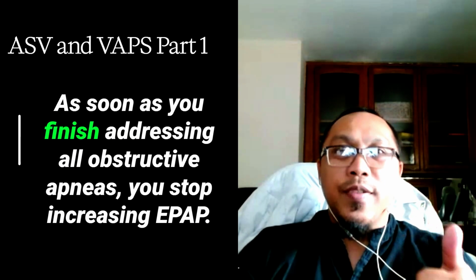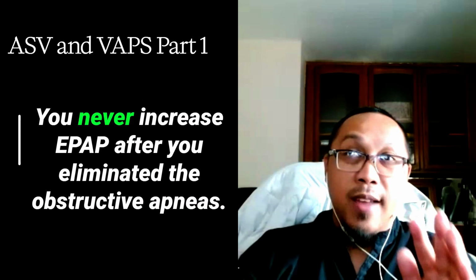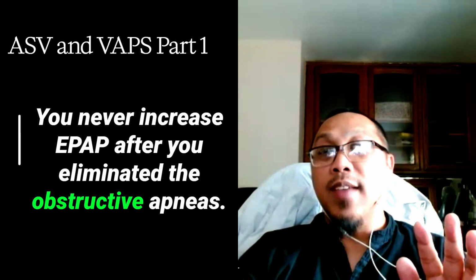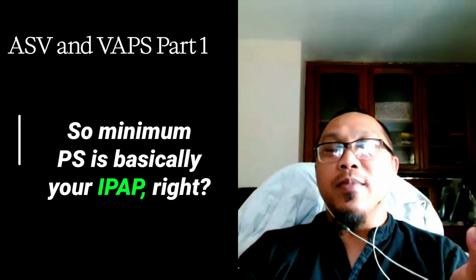As soon as you finish addressing all obstructed apneas, you stop increasing EPAP. You never increase EPAP after you eliminate the obstructed apneas. You got it? You now just increase the minimum pressure support. So minimum pressure support is basically your IPAP, right?